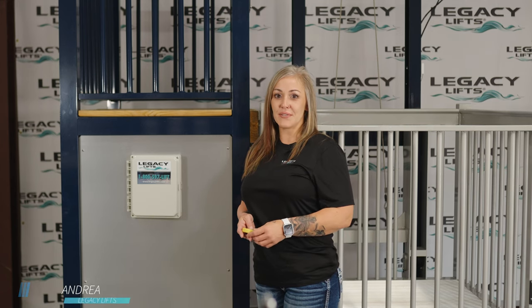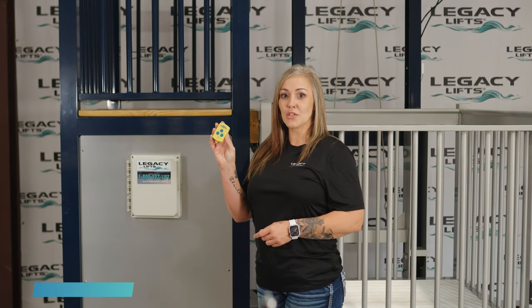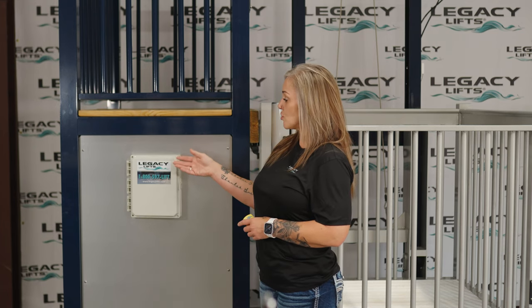Hi, I'm Andrea with Legacy Lifts and today we're going to teach you how to program your remote. Grab your handheld transmitter and locate your control box.